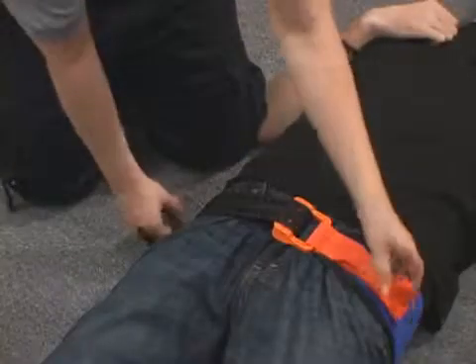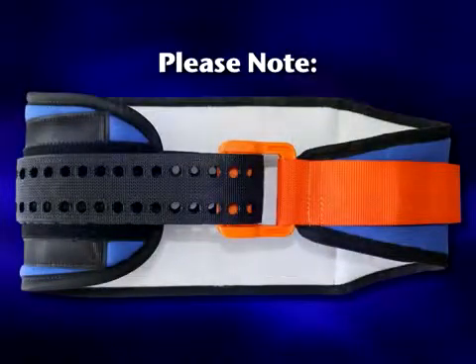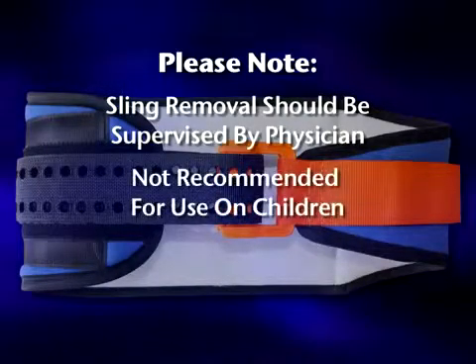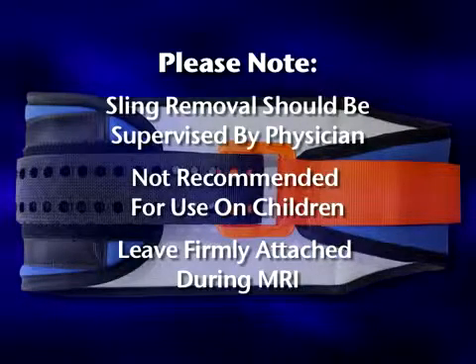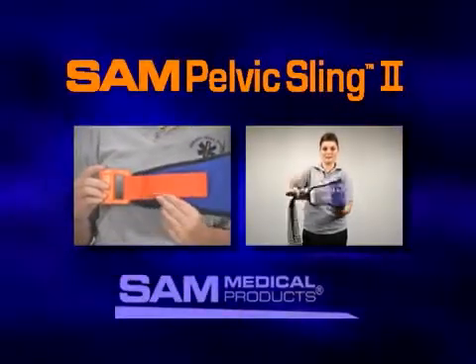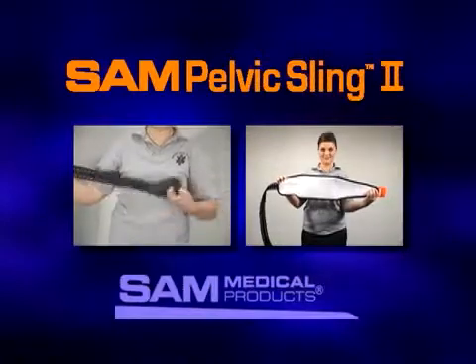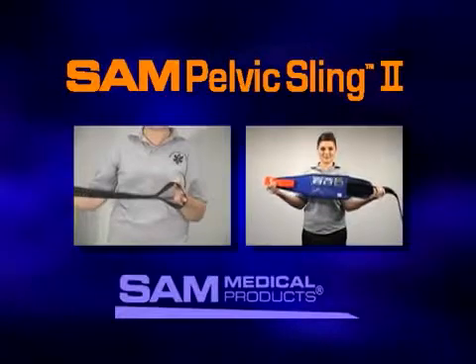To release the pelvic belt, lift the free pull handle away from the belt and slowly release tension. Please note that the SAM Pelvic Sling 2 should be removed only under the supervision of a physician. This product is not recommended for use on children. The SAM Pelvic Sling 2 should remain firmly attached to the patient while in the MRI room. The SAM Pelvic Sling 2 — the first and only force-controlled circumferential pelvic belt designed to provide safe and effective reduction and stabilization of pelvic fractures — available in both civilian and military colors.